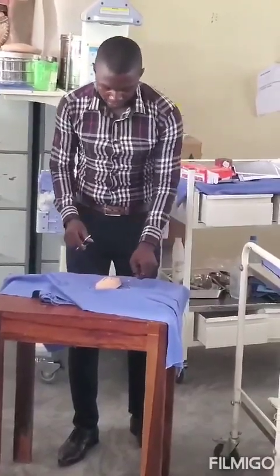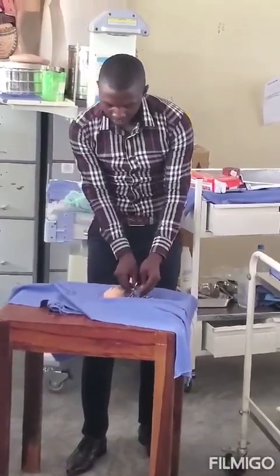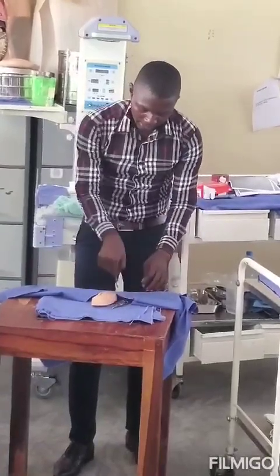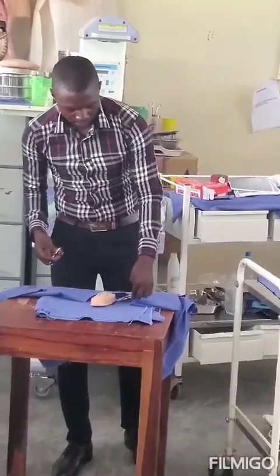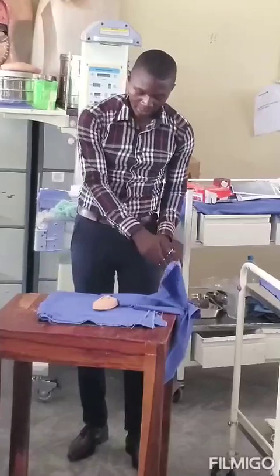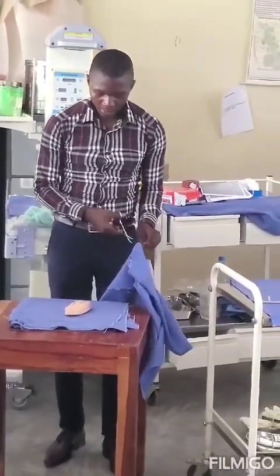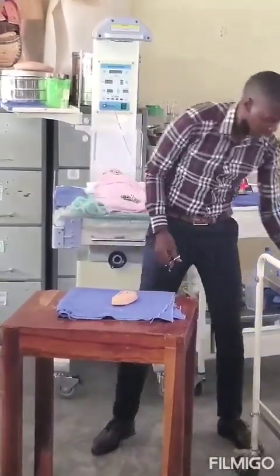So you start now, you remove everything and say, thank you so much, Mr. X, for allowing me to do the procedure. I'm done performing, so you get these forceps, you're going to drop them here. All these forceps, you're going to drop them in 0.5% chlorine. Thank you so much, Mr. X, for allowing me to do the procedure. I'm done suturing, and this is going to promote healing of your wound and also minimize infection levels.